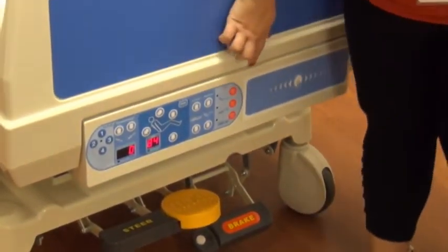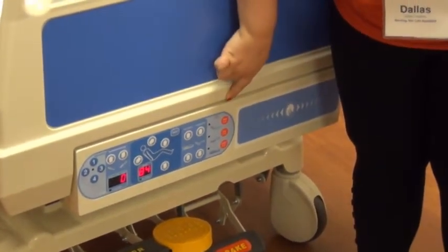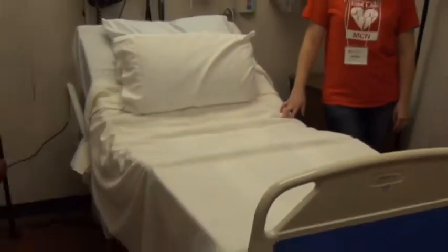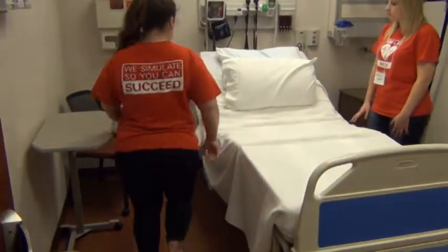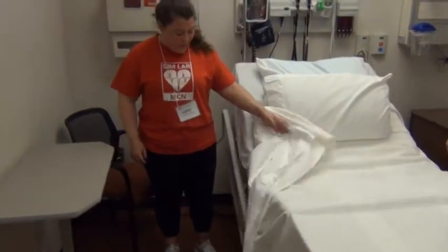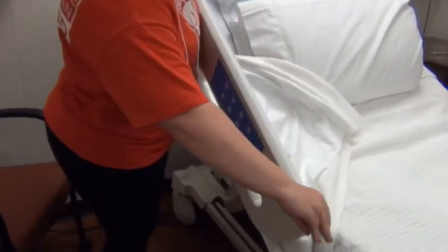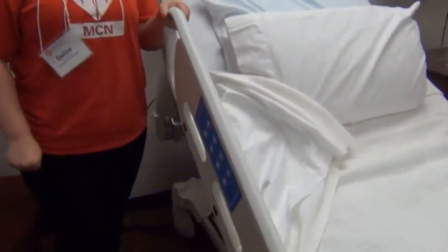Here we have our panel to put the head of the bed up or the foot up, and you can always put it down. There's also panels on each side rail. In order to put the side rail up, all you want to do is pull up and the side rail will lock. If you need to put the side rail down, pull this lever and the side rail goes down. If you ever need to do CPR, the lever is right here. You pull it and the bed is in position.